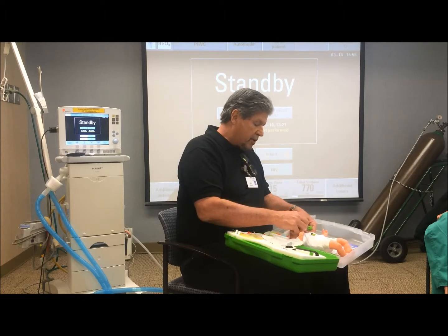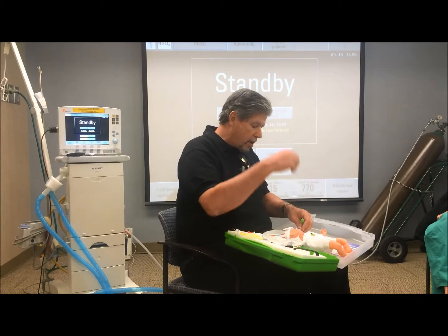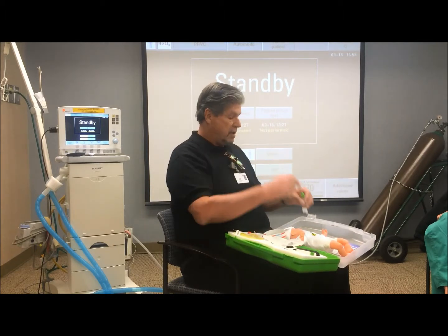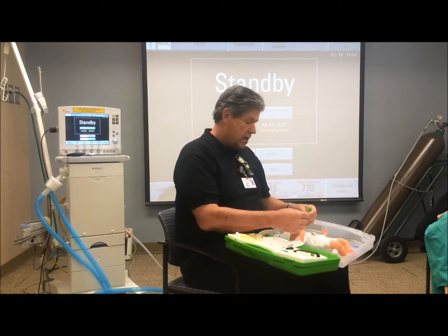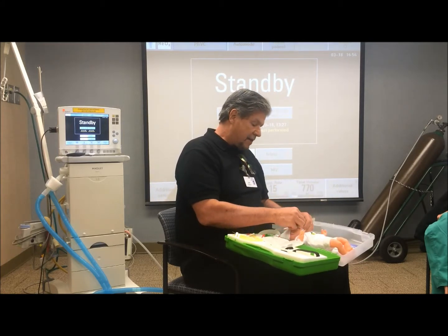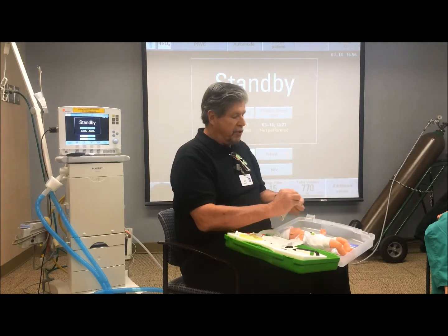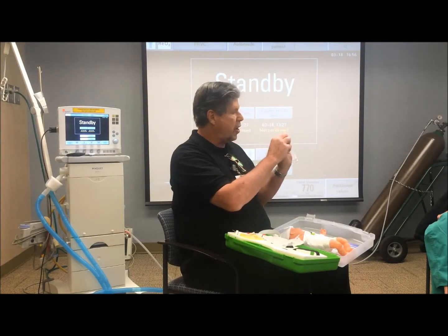And when you insert the prongs, you don't want to push this all the way in so it's all the way up against the septum. You want to put it in about halfway. So if you select the right size, put it in so it's halfway. And what you would do is put this in first, because this requires a little bit of push to get them into the hard plastic.